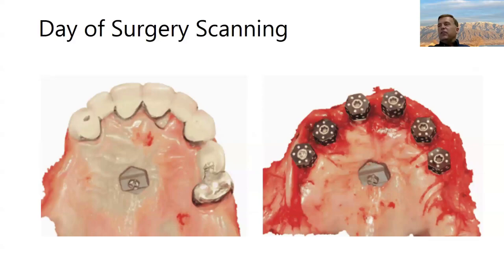Day of surgery scanning is difficult. As you can see, you'll be scanning odd-looking things. You'll be scanning in a bloody field. You'll be scanning under time pressure. So it's good to develop this skill before you need it. I would say reference dentures are a good way to practice, but make sure you have a person and a backup person that can take these day of surgery scans because they need to be perfect. If they're off, and we'll talk about this, the occlusion of the tooth position will not be the cool result that you planned.